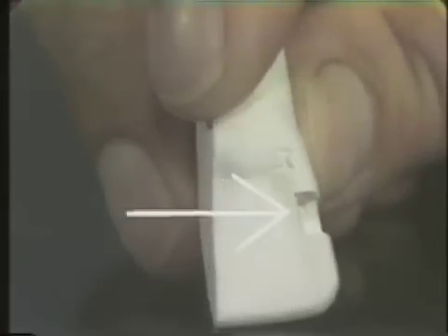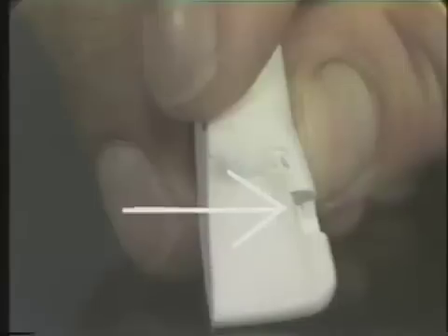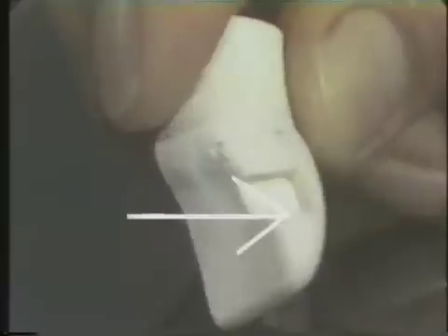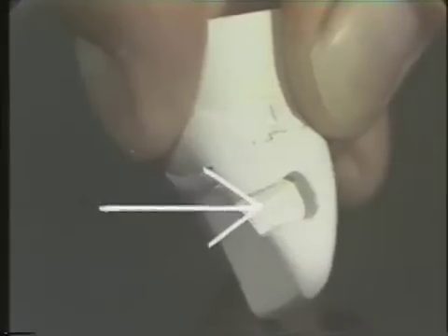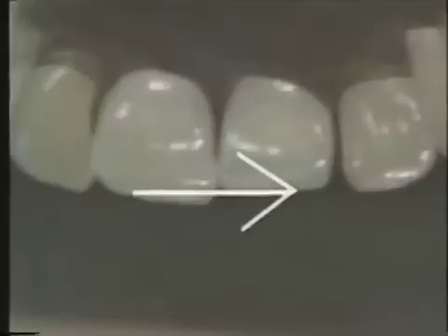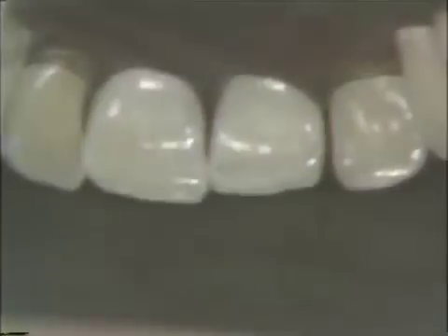The actual cavity preparation that we're interested in is here. Notice the lingual opening. Cavo-surface margins have no bevels. As we look at it interproximally, we notice that the extent of the preparation drops toward the incisal, curves with the labial, and drops again to the cervical, and then comes out to the cavo-surface margin on the lingual. If you notice the retentive grooves in the incisal, cervical, and labial.